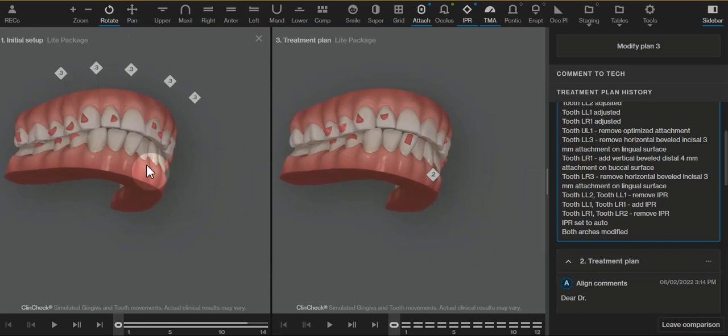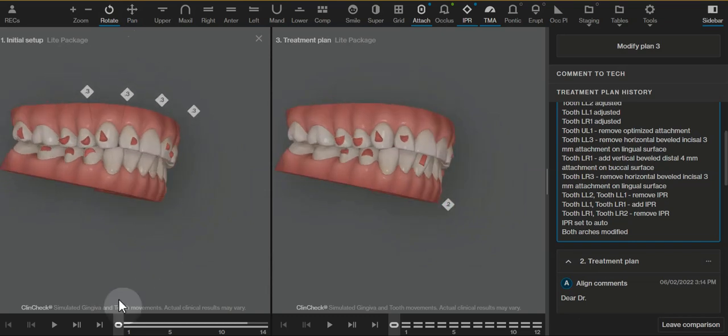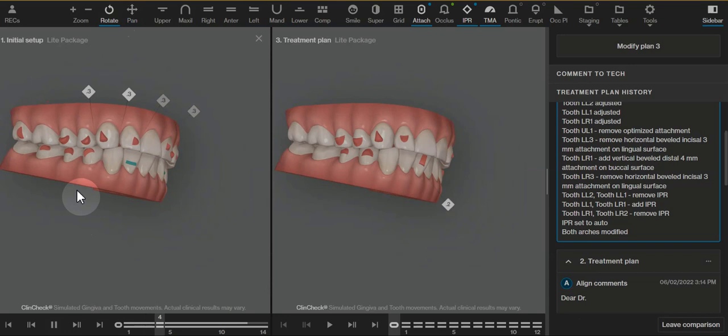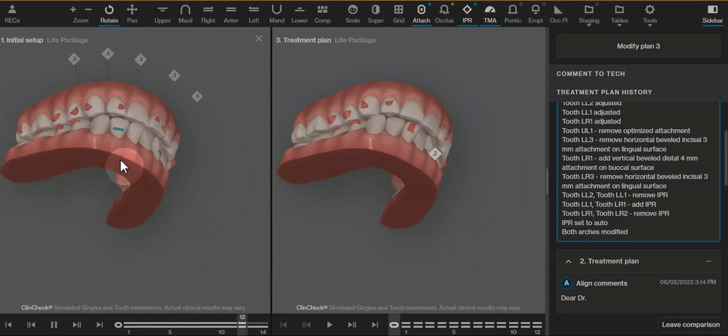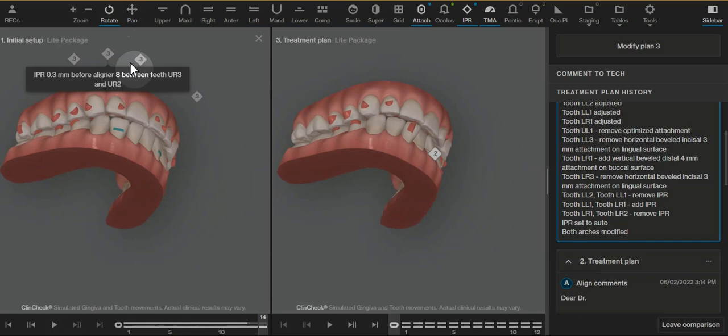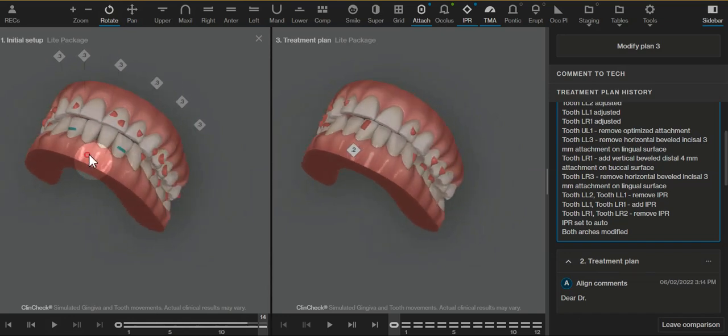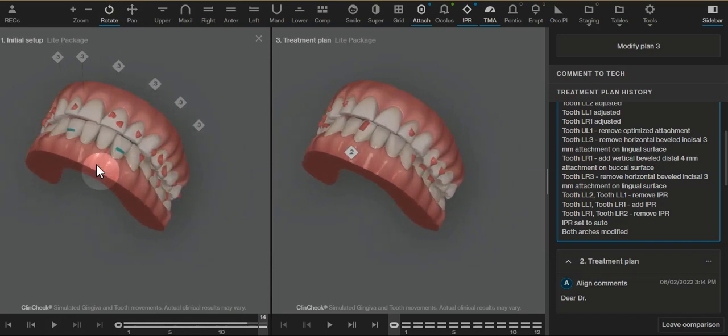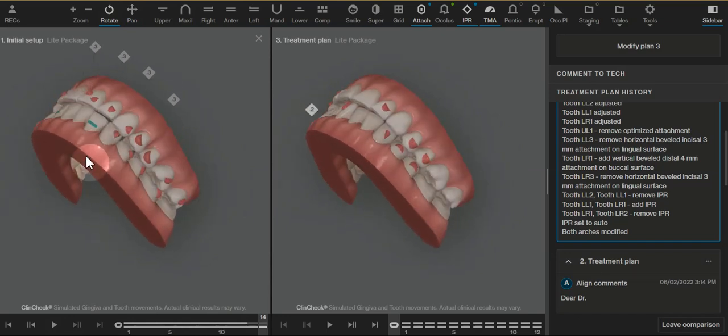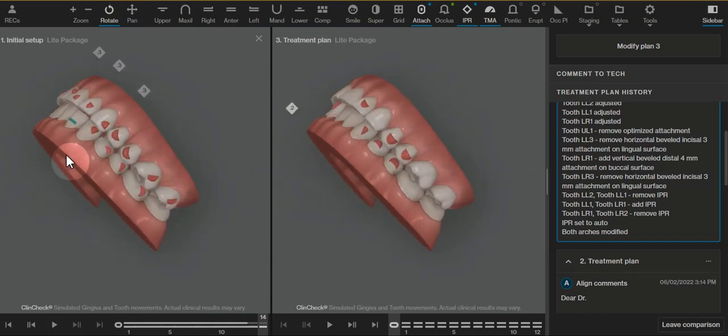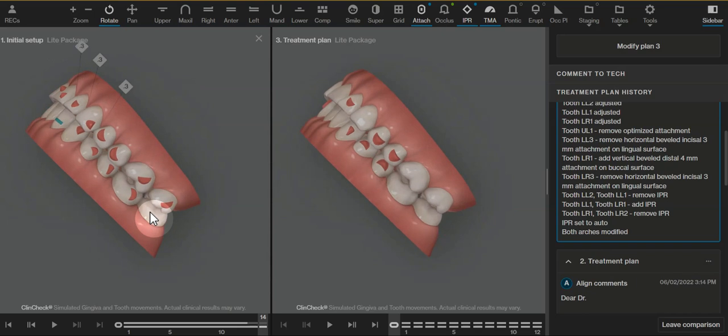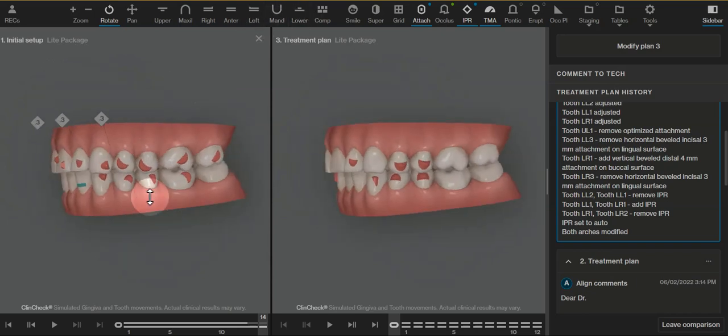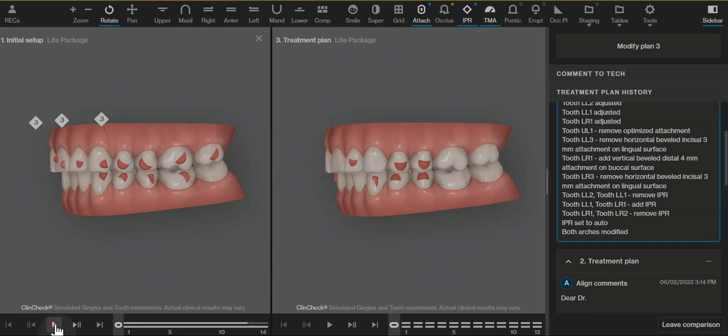The initial clincheck is only 14 aligners and is tempting to approve, but has a posterior open bite and unpredictability written all over it. The upper IPR allows the teeth to finish almost in a different form of an end-to-end bite, and all of the molar movements are not predictable nor needed for this case. They're really distracting to just correct the upper anterior.